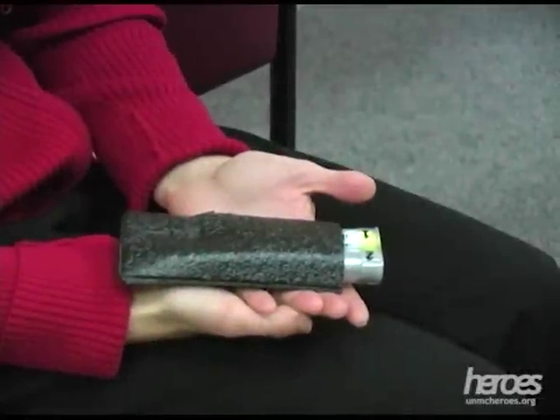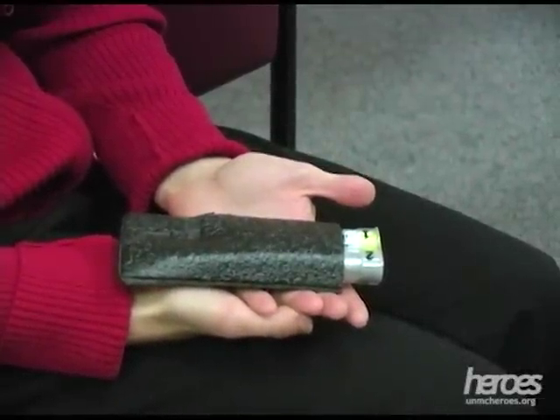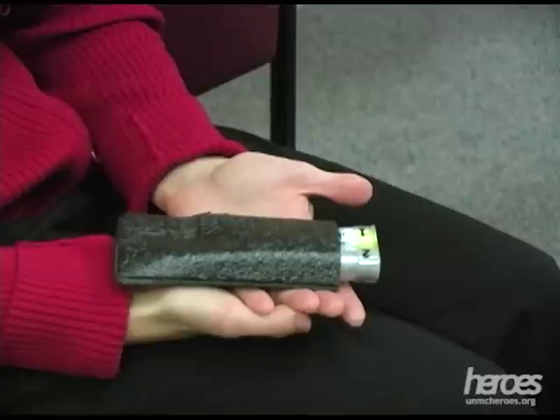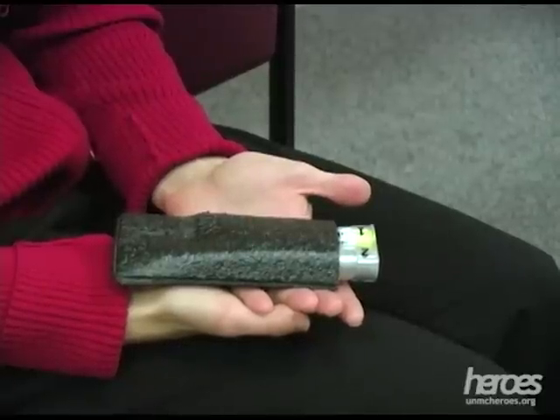We will now demonstrate administration of a Mark 1 kit with a training device. The training device is activated in the same manner as the actual auto-injector, but it contains no needle or drug. These training devices are available from the manufacturer.